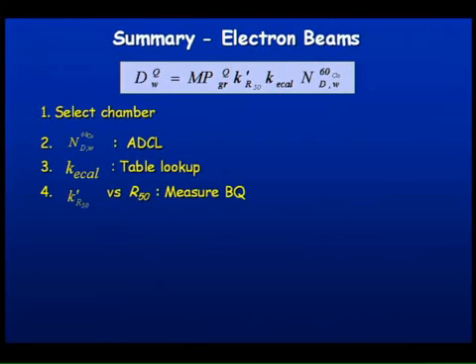This factor is a photon-electron conversion factor. This is an electron quality conversion factor. It is given as a function of beam quality, so you need to measure beam quality. The protocol tells you how to do that.